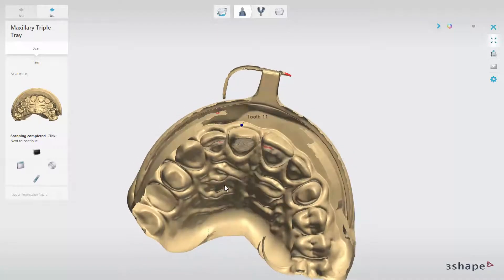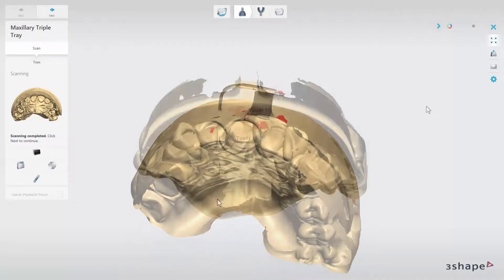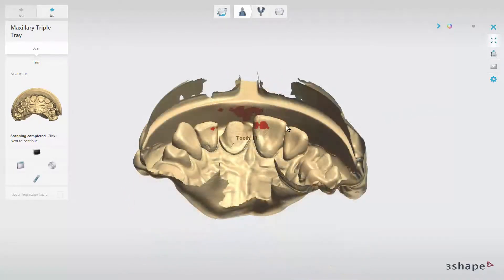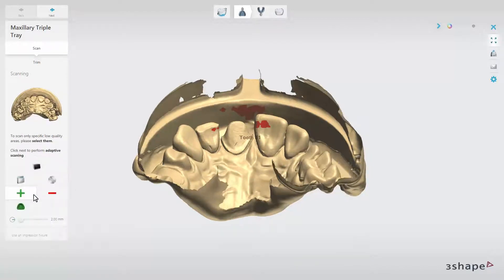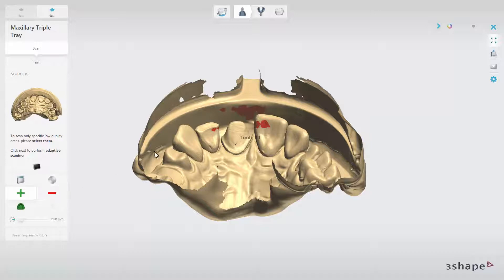When the scan is ready, and red areas occur on crucial parts of the impression, you can enable the adaptive scanning option. The adaptive scanning option can be used for both the restoration and antagonist impression scan.